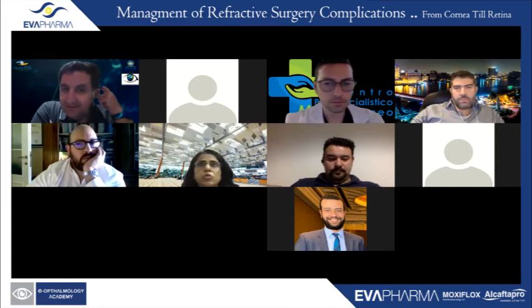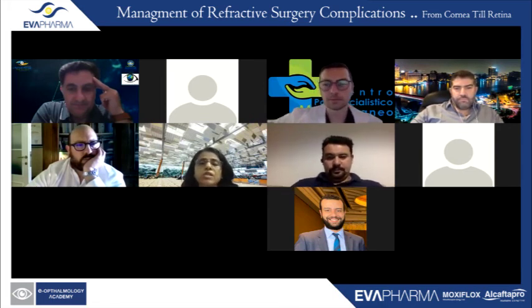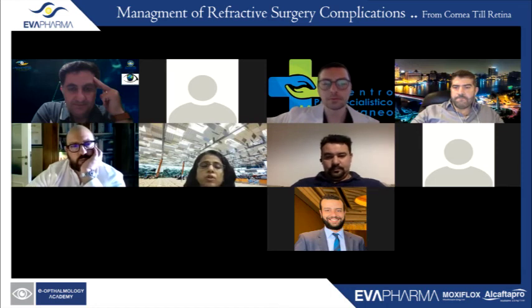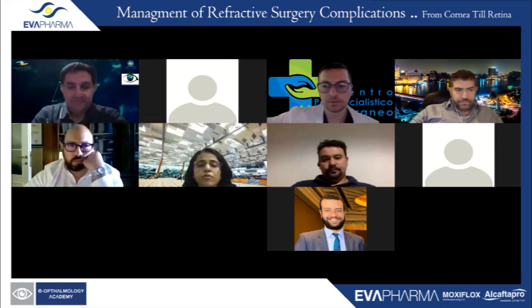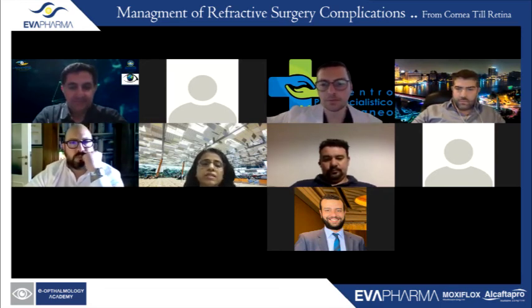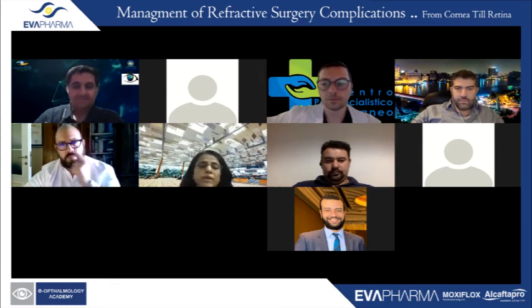The other thing is you need to know about the white ring sign, which is very, very important. And there's also another way of dissection of the SMILE lenticule, which I also published in JCRS, which I call a sequential segmental lenticular side cut dissection. That's again a very important way, especially for thin lenticules, because thin lenticules are what can tear and possibly cause postoperative topographic abnormalities. As long as you follow the techniques, anterior dissection first, followed by posterior dissection, and keep anchoring points on both sides of the lenticule so that it is not moving around freely but is anchored at both sides till you've almost finished all your dissection, these are important points which help you do a SMILE uneventfully.